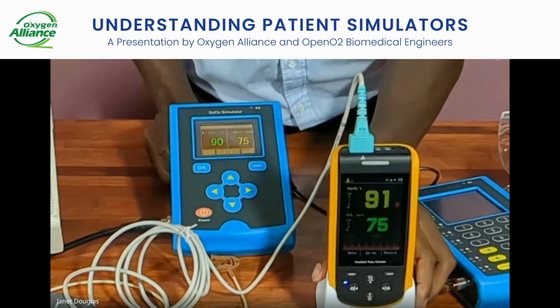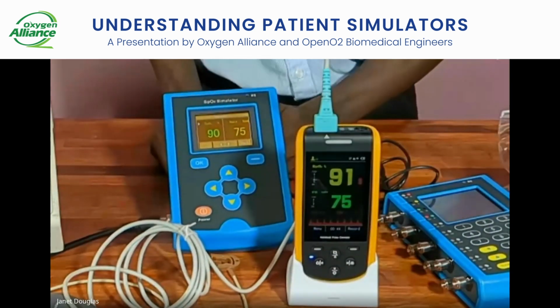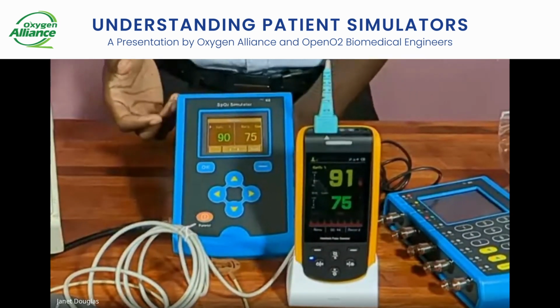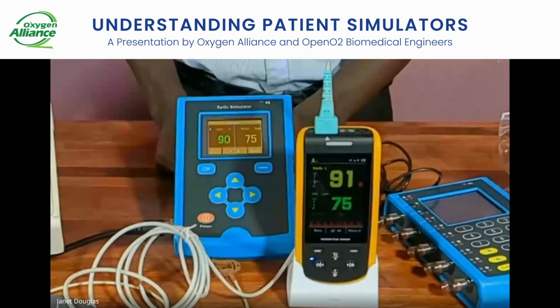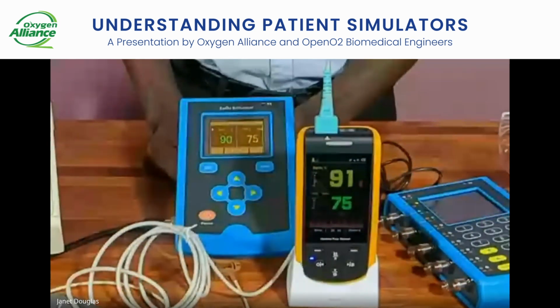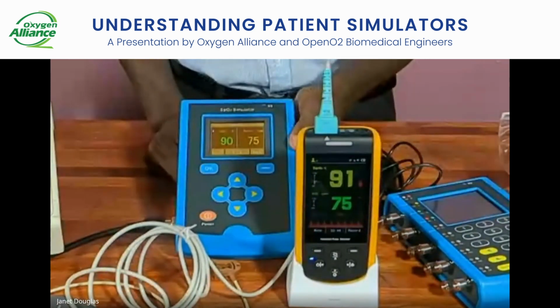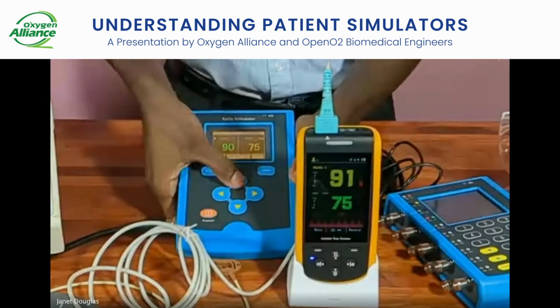We're getting 91 for the SPO2 and 75 for the heart rate, which is okay because they usually have a tolerance, which is also indicated in the manual, but it might be somewhere around minus or plus 1% or something like that. So it's advised that you check the manual and make sure that whatever values you're getting are within the recommended tolerances.